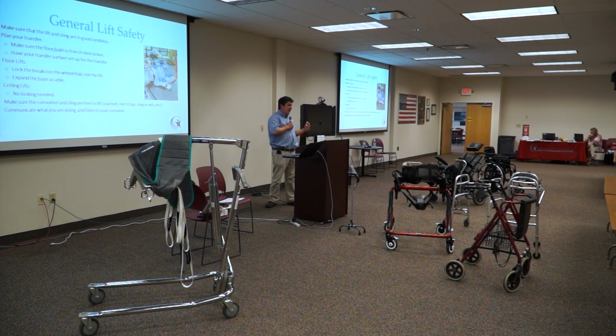So many of our consumers might not be verbal, but this is a social, emotional component. Most of our individuals who require this level of assistance have received it their whole lives, but we also have to remember that they're people and not objects to just be moved. So always give a person the benefit of the doubt, that they understand what's going on, and that you're acknowledging them as a person, giving them warning. Hey, we're going to lift you on 3, and if they are verbal, listen to what they're saying, right? And then give assurances when they're up, and always request help if you feel like you need it.